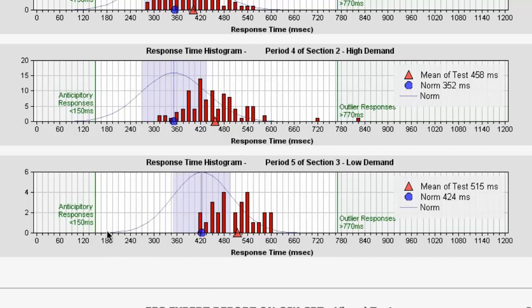We also see the anticipatory responses here. Here's that 150 millisecond line cutoff — if somebody were to respond faster than 150 milliseconds, we would categorize that as anticipatory. And here we would categorize this as an outlier.